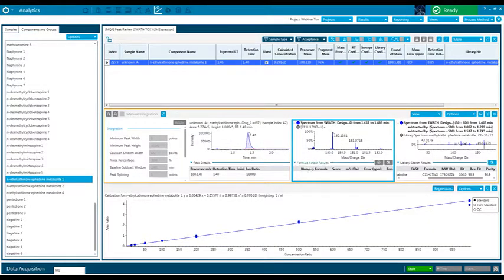Thanks to this processing, I have a very good confidence in identification, and I'm able to quantify directly my compound in this unknown sample. At the end of the processing, I can create a report with the reporting feature. I can create the report and save the results table. I select, for example, a template. I can see an example there with tables, chromatogram, and spectrum comparison.